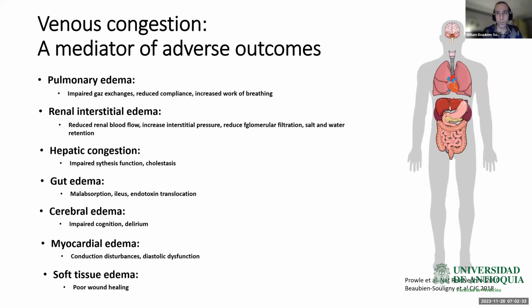So these are not new signs, because most of these abnormal venous Doppler waveforms were described in the 80s and 90s by radiologists and cardiologists. But maybe because they were described in the echocardiography lab or the radiology department, the clinical implications of these signs were not readily apparent to these physicians.